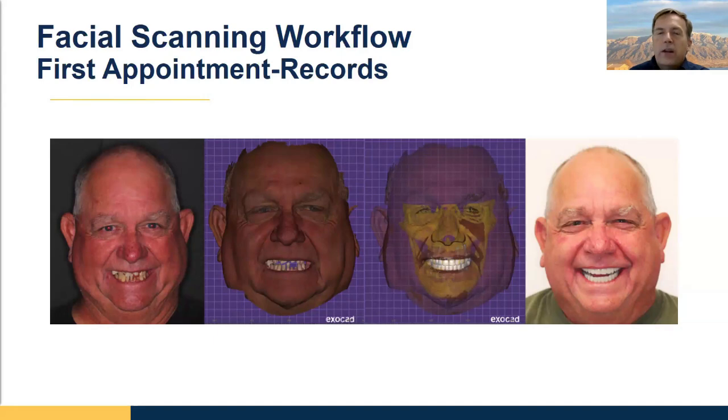For instance, you carve up a bite block and we say to ourselves, okay, looking at the bite block in the photos, I can tell that if I put the teeth in this position, it'll support the person's face. I don't know exactly how it'll look in their face, but also, if I get a study model, it's like, okay, this is something that looked good in the person's face in the past. And this is different than a photo.